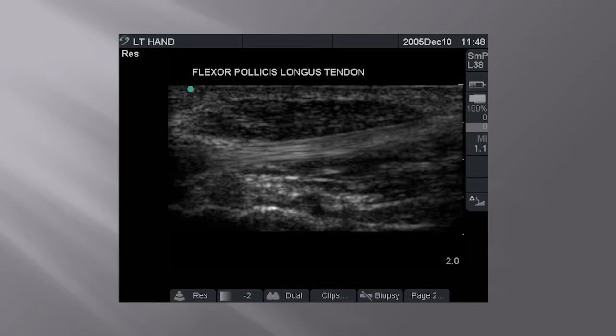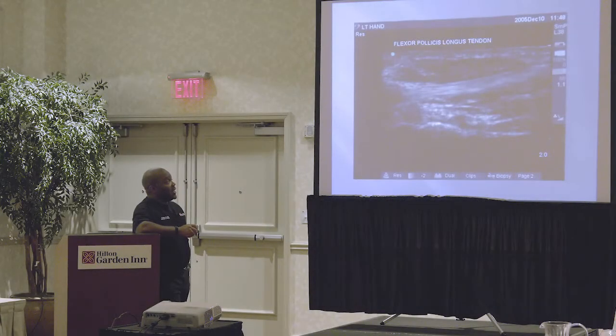Why is that helpful? Well, if I were draining an abscess, and if this were not a tendon, but if the abscess was here, then I need to know that this is about 1 centimeter, and I need to know what size needle that I should choose, okay? If I were trying to do an ultrasound-guided IV, for example, and I can see my vessel here, then I know that's about 1/4 centimeters down, versus if my vessel is here, I'm making this up, it's not here. So don't look for the vessel, it's not there. You're not crazy. But if the vessel were here, I would know that this is closer to 2 centimeters and I know what size IV catheter to use. All right, so that's how the depth is gonna help you.